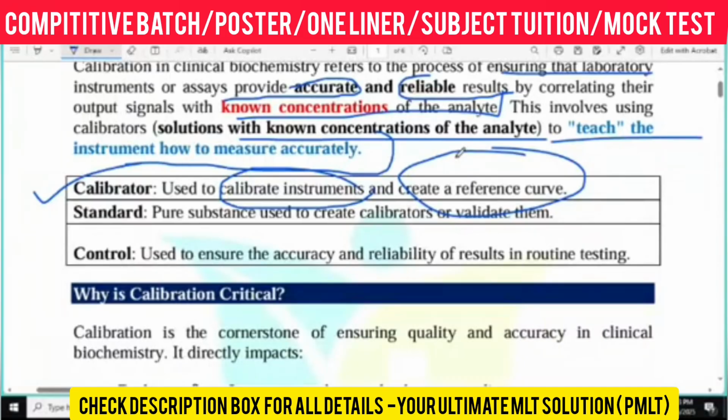After that, the standard is a pure substance. If I am talking about the standard of glucose, that is 99.9%, almost 100%. No other particle should be present in a standard. A standard is only the pure substance of this particular reagent.